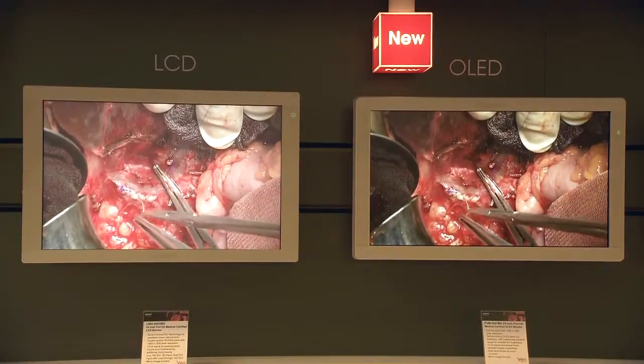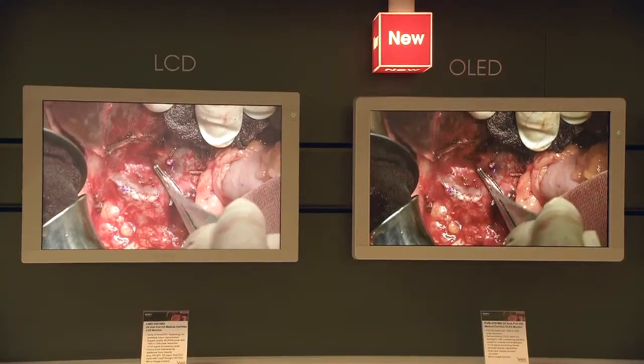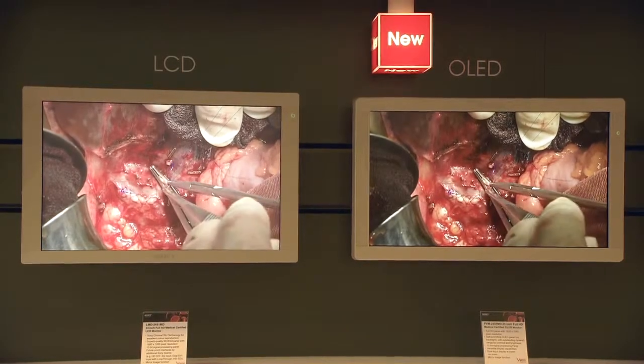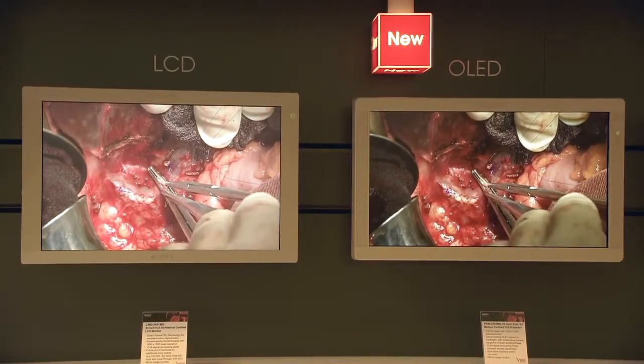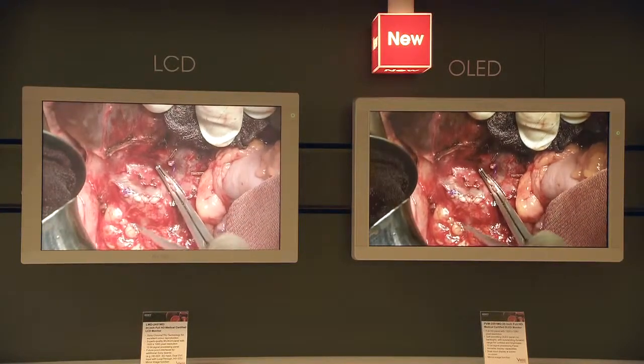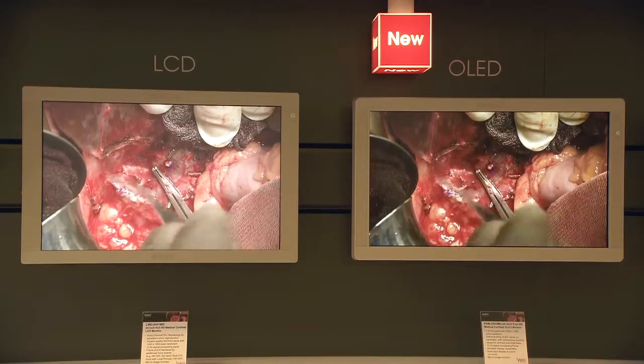As soon as highly reflective surfaces of body tissue or bone come into the picture, as in arthroscopy, or when surgical cutting instruments like shears or pliers reflect from the light source into the scope camera, the picture becomes overexposed by LCD monitors. As a result, the surgeon can be irritated by such reflections, and the colour reproduction is also reduced on LCDs in high brightness conditions.